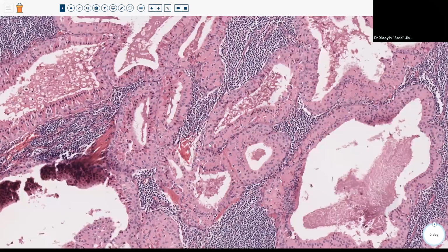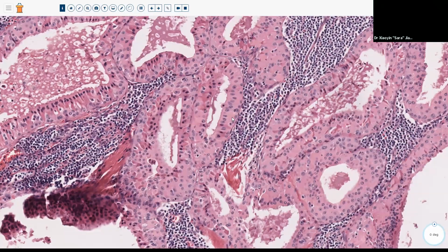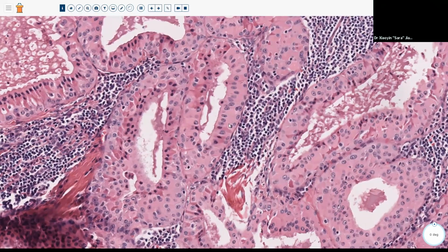they have a characteristic, of course, as with all oncocytes anywhere in the body, you have abundant cytoplasm, some of which is granular. It's kind of hard to tell from this power. This is as high up as we can go, but the cytoplasm is very granular, and that's because they're full of mitochondria. So back in my day when dinosaurs roamed the earth, the boards might show you an EM photomicrograph of a bunch of mitochondria in a cell, and the answer was oncocytoma. And so oncocytes anywhere in the body are going to be filled with mitochondria.